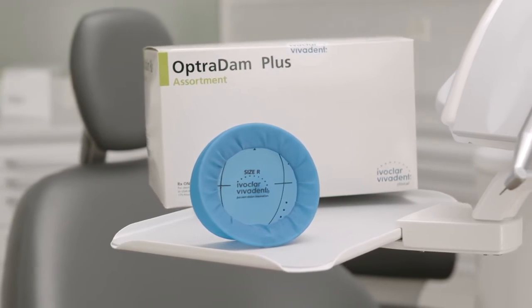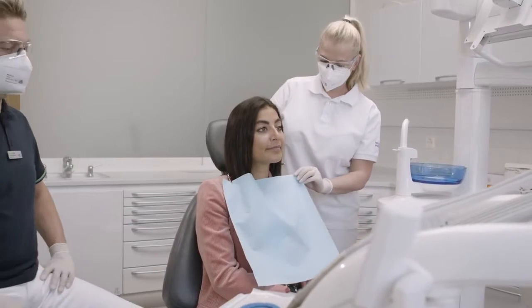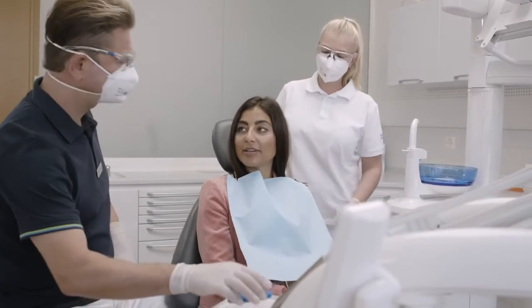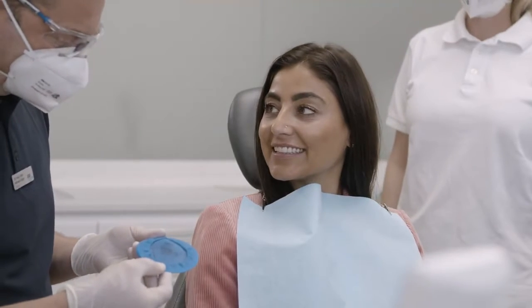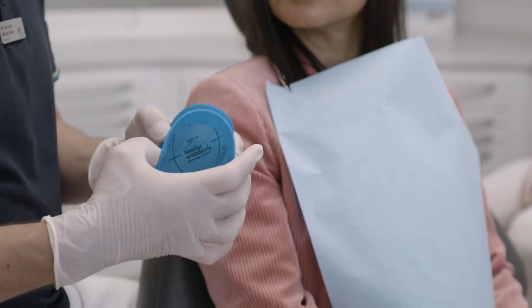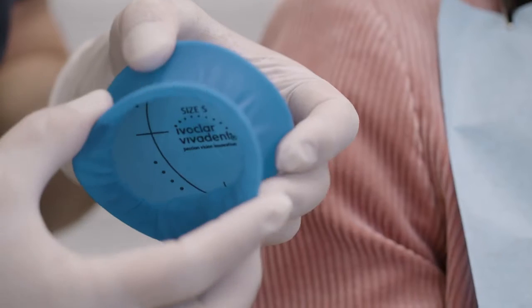Optradam is a three-dimensional rubber dam used for absolute isolation to control the spread of infectious disease and aerosols in the practice. It features high flexibility and elasticity in all directions, provides patient comfort, and assists in keeping the patient's mouth open.